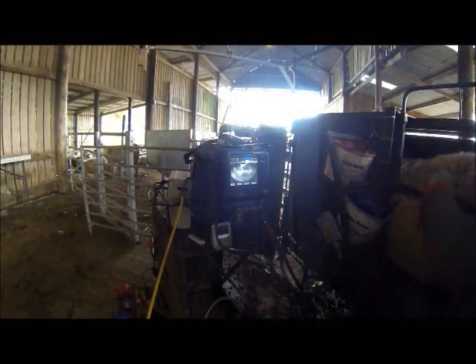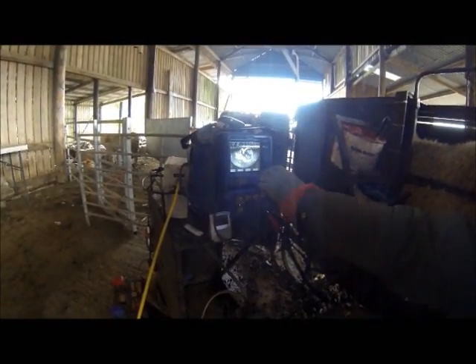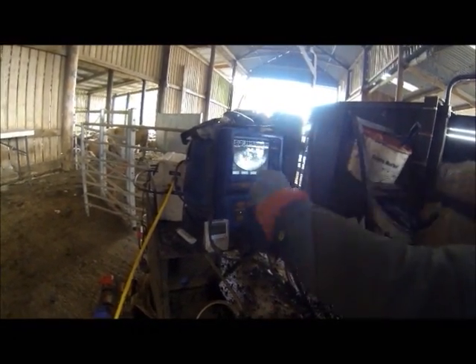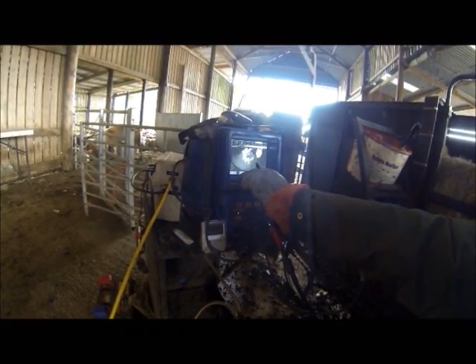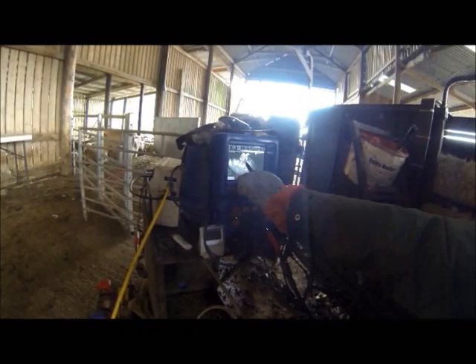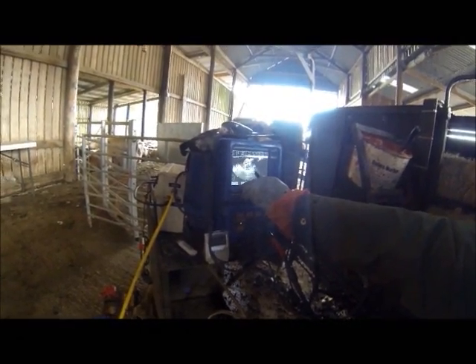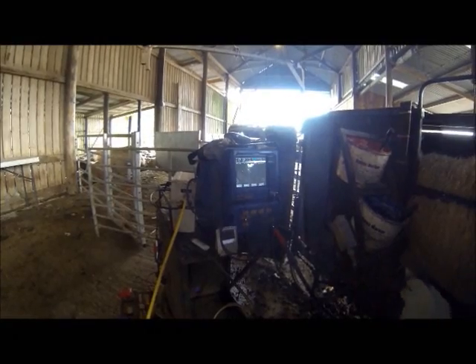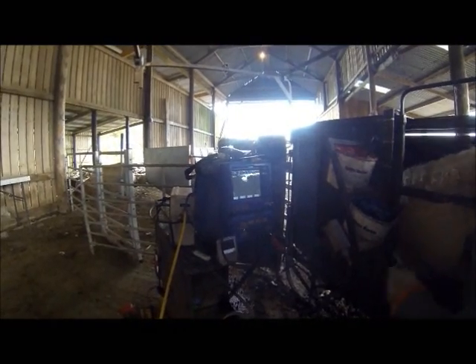The scan man uses the handheld ultrasound scanner on the outside of the ewe's belly. This relays a picture back to a video screen. From this, the scan man can identify the lambs — the lambs' bones show up white, and the spine is an often depictable image. Once all the lambs have been identified, the scan man gives the ewe the appropriate coloured mark, or no mark if she has twins. He also presses appropriate numbers on a handheld remote, which gives us a count of all the sheep scanned and how many are carrying one, two, three, or more lambs.